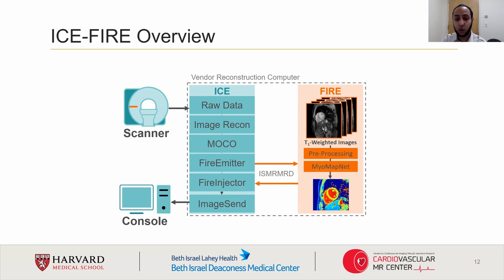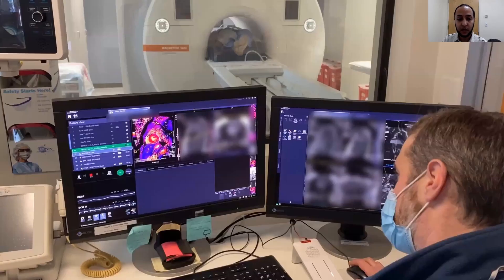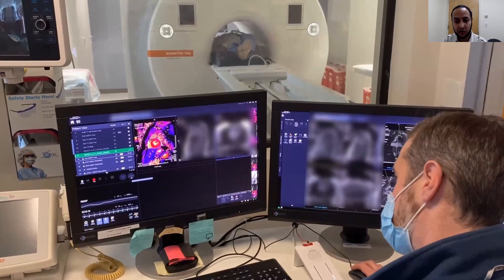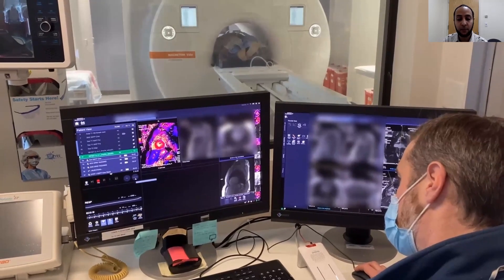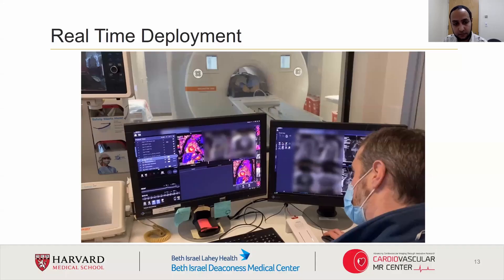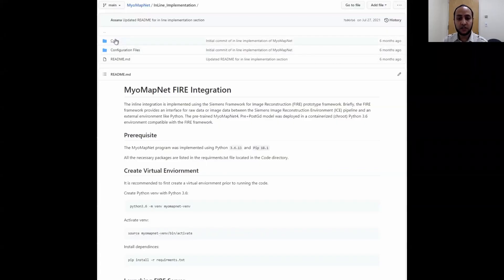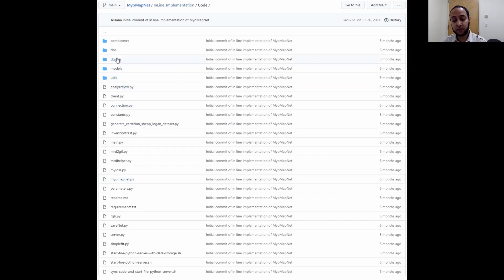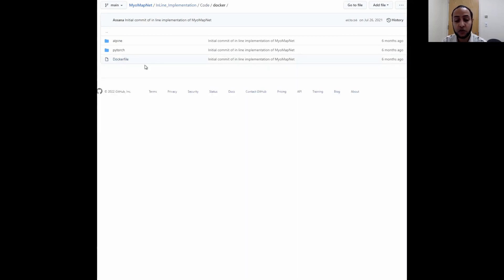In the case of MyoMapNet, we experimented with using a U-Net architecture in place of a fully connected network. Here, you can see an MRI tech run the modified sequence on the scanner and the T1 map appearing on the bottom right of the screen. On our GitHub repository, you can find the MyoMapNet program, which has been modified for deployment on the scanner. You will also find the Docker script used to build the chroot image under the Docker folder.